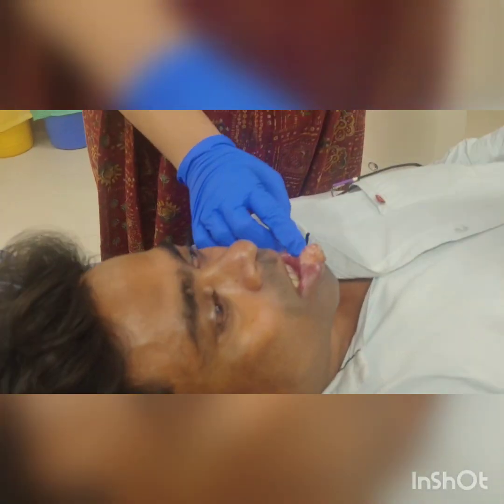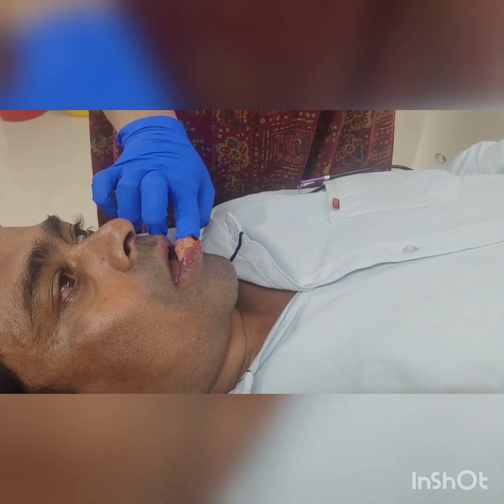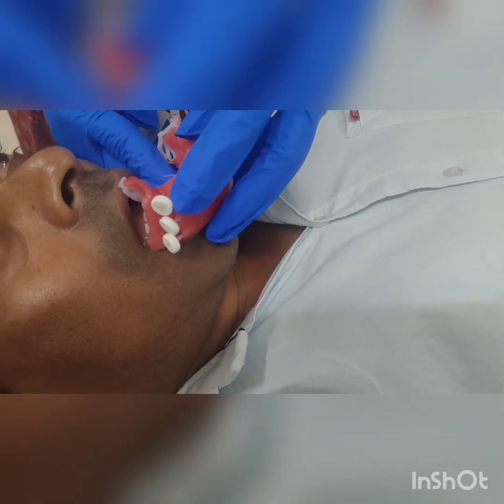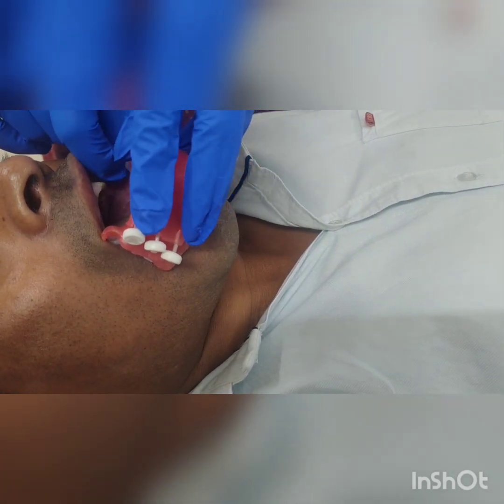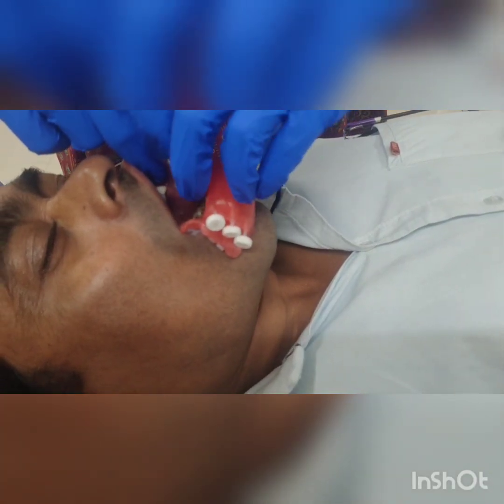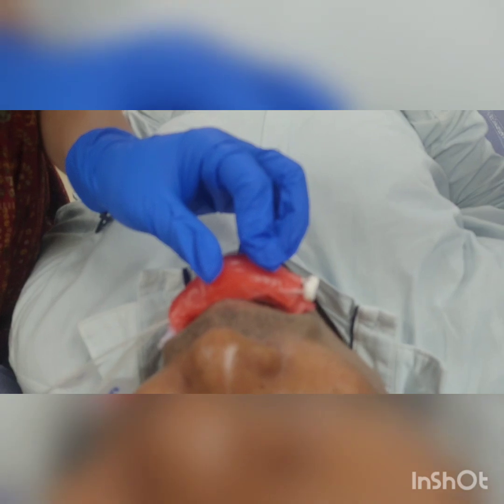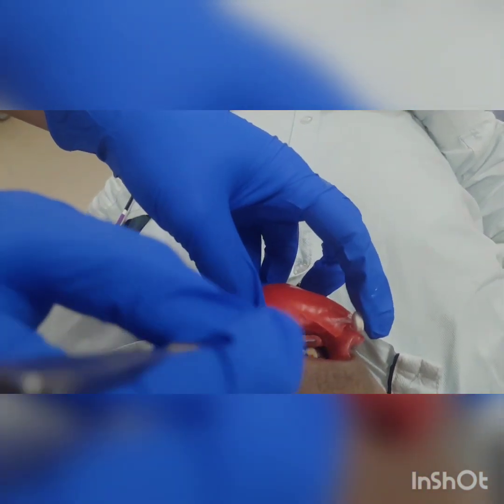When applying the mold, apply some gel and jelly around it so it acts as a lubricant for proper placement as well as a local anesthesia. Now see how it is applied. It's fixed — you can see. In between the mandible we will give some lead blocks to decrease the dose. Lead blocks should be covered with wax to prevent backscatter.